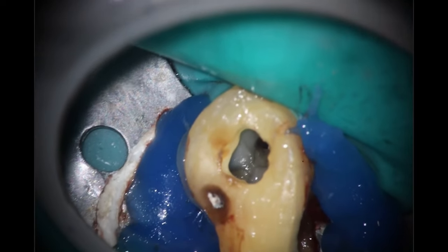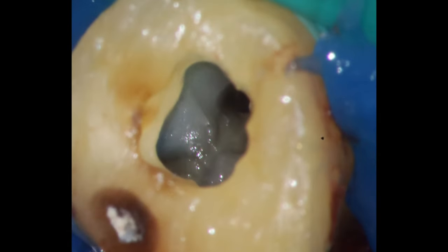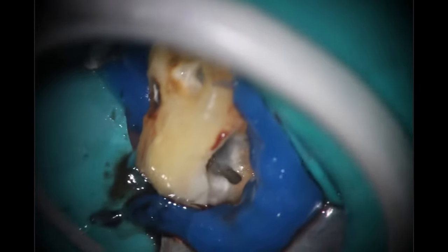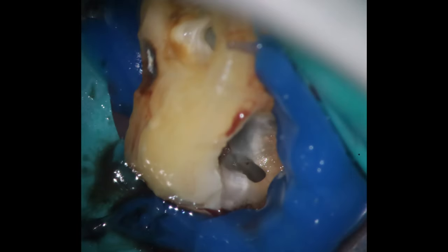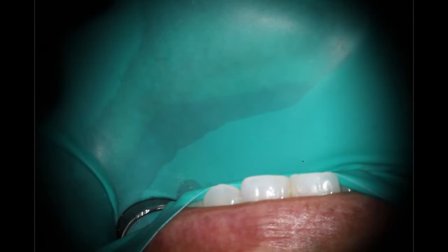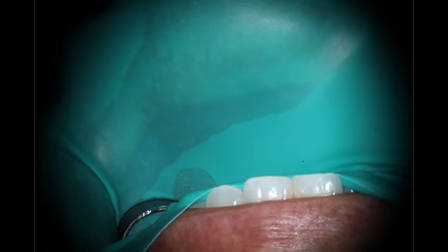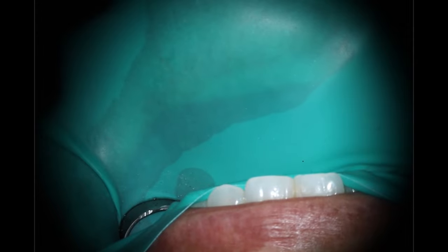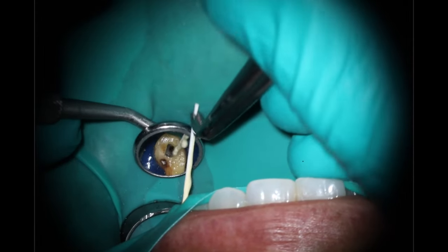I'm going to take a couple quick still photos here. And as you can see, that's what our MB and distal buccal looks like, and then this is what that palatal looks like. Trying to get an angle here — you can see just how beautifully that block-out resin creates almost a shape that will hold everything inside there. So at this point, we're going to go ahead and obturate the case. Now in my head, I'm trying to figure out which technique I'm going to use — am I going to be doing a squirt fill like normal, or am I going to be using a cone? In this case, I'm going to use a hybrid.